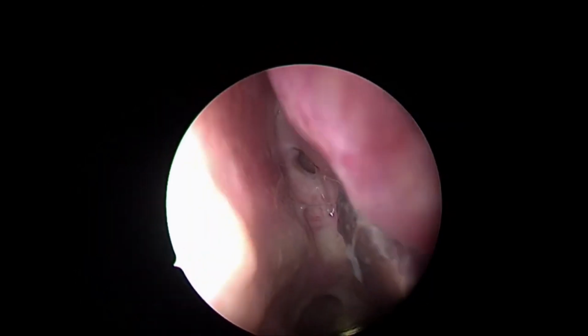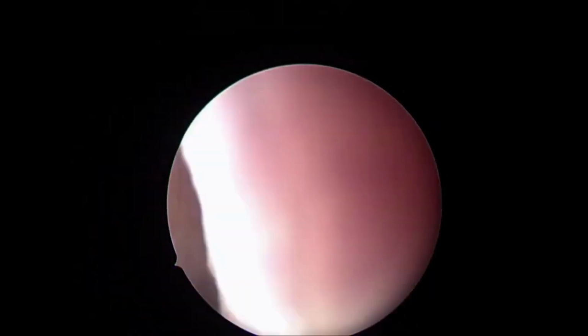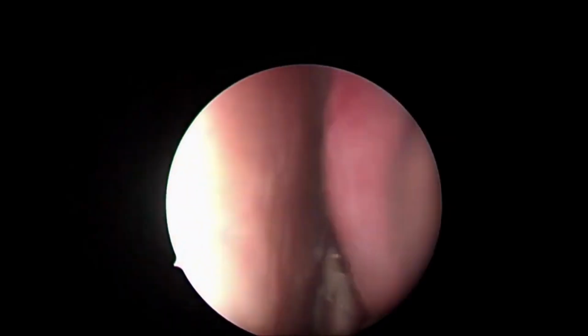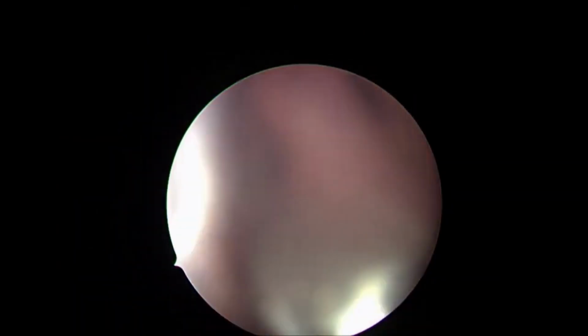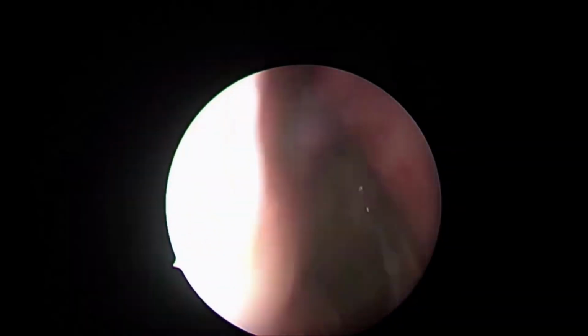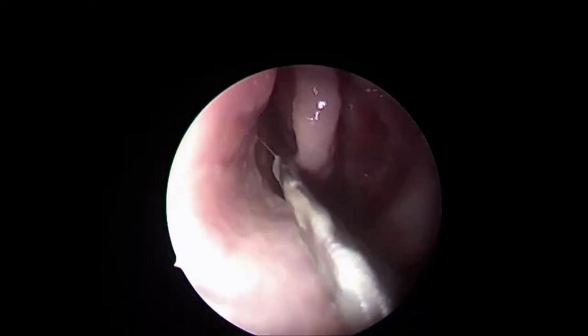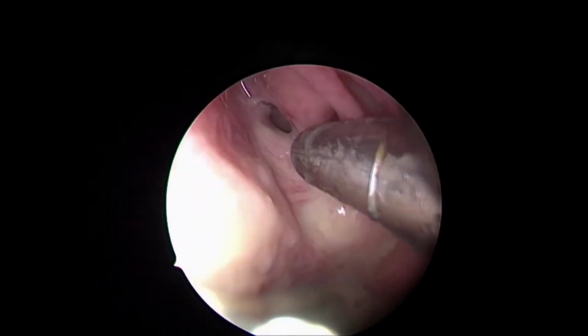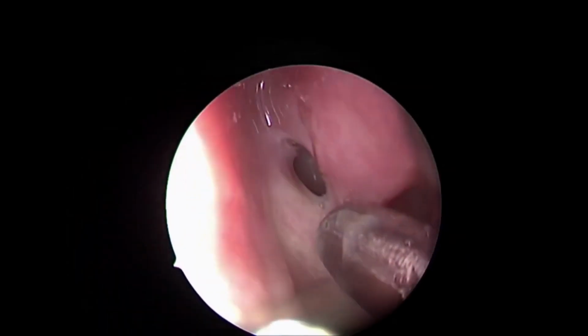As I told you, behind this ground lamella is the posterior ethmoid sinus. So the posterior ethmoid sinus and the sphenoid sinus drain behind the ground lamella, and that region is known as the sphenoethmoidal recess. This sphenoid sinus is considered, for the skull-base surgeon, to be the center of the universe.